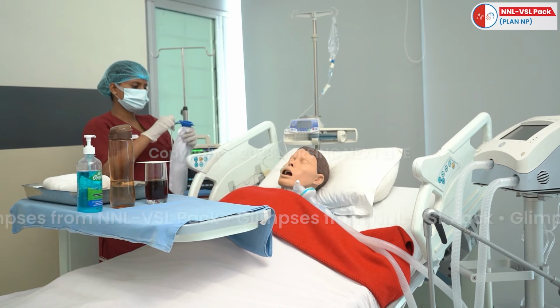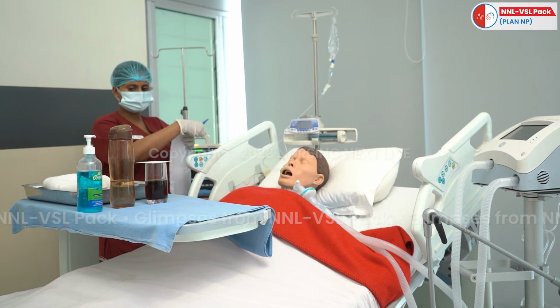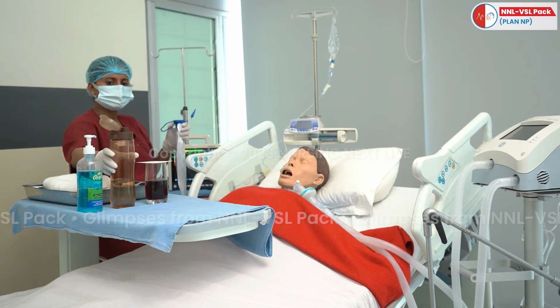Fill the gravity bag with water for pre-flushing the nasogastric tube. Make sure that there are no air bubbles in the tubing.